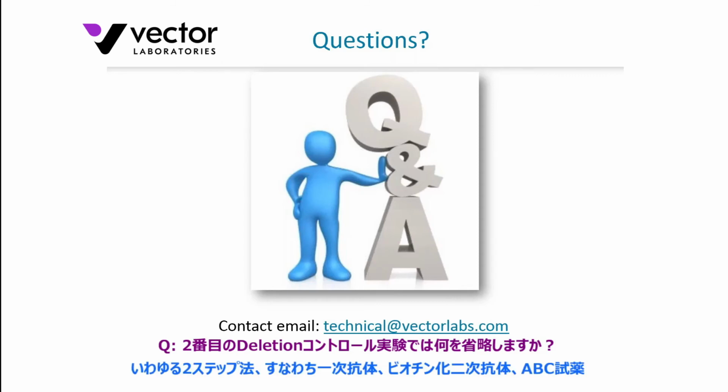Potentially, if you're using a two-step methodology, if you have a primary and then a biotinylated secondary, and then say an ABC reagent and the enzyme substrate, you're actually deleting the first three reagents and you're simply applying the enzyme substrate. In the second deletion control I was mentioning, you're omitting the primary antibody, and you are applying the secondary detection reagent and the enzyme substrate.